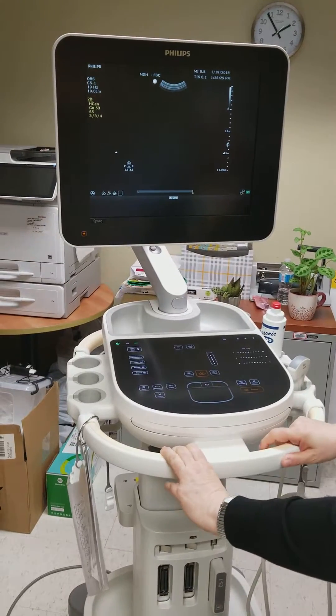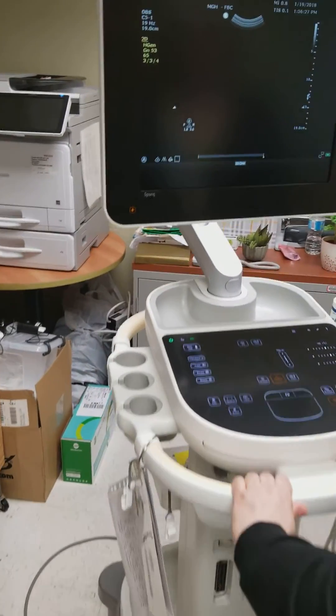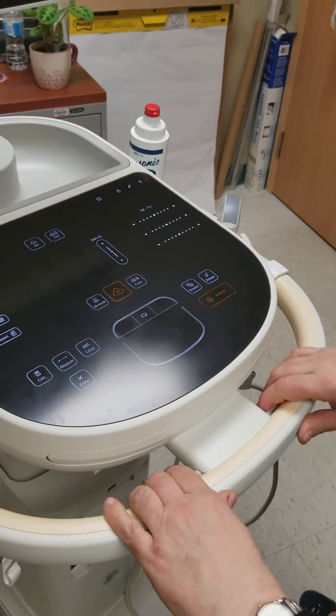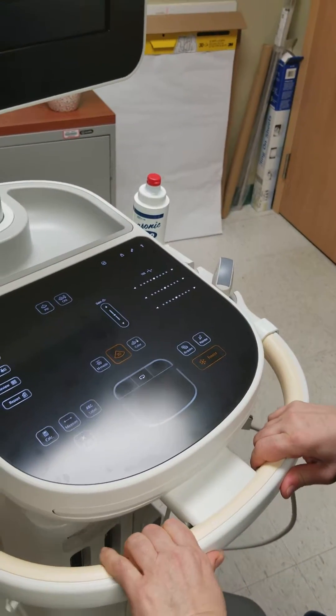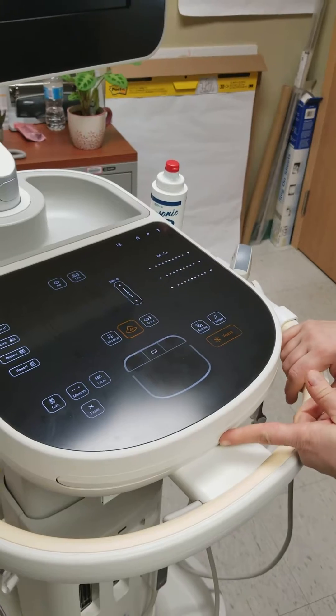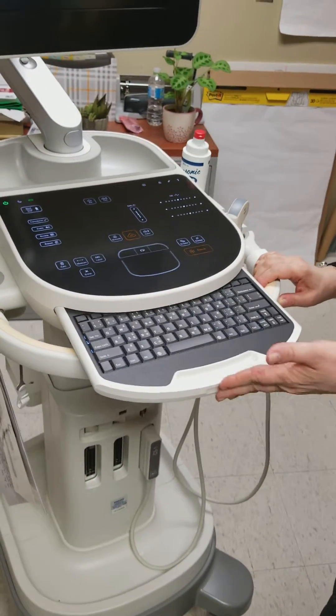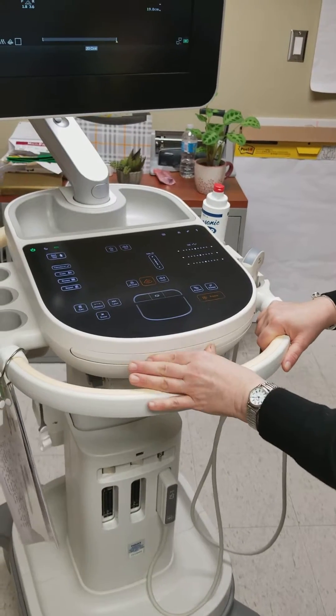Another feature of this machine is that it can go up and down. Just squeeze these two little buttons and you can move it up and down — so if someone's sitting, they can adjust the height. If you press here, the keyboard will come out. These features are mainly ones that the physicians will be using.